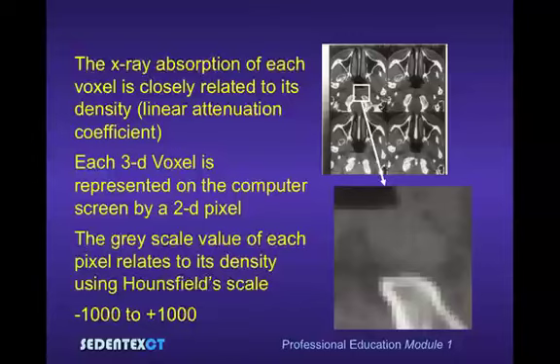Let's try and explain what we mean by this Hounsfield scale, because it is relevant in some ways to cone beam CT.